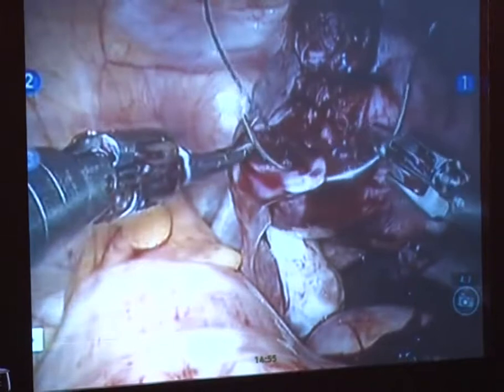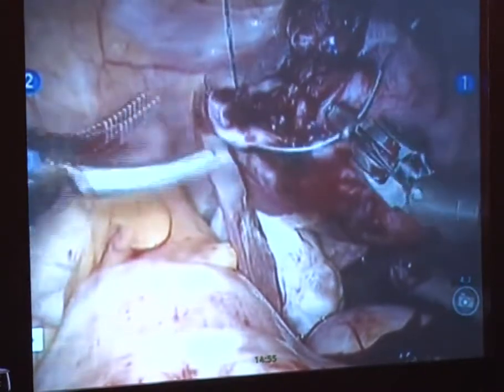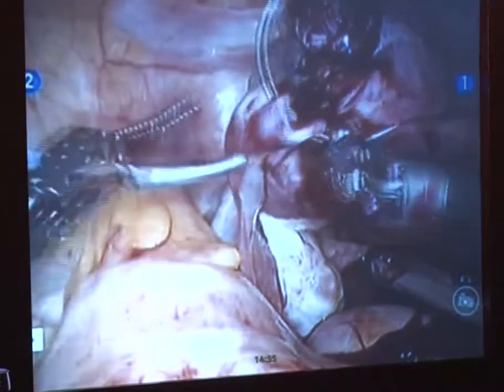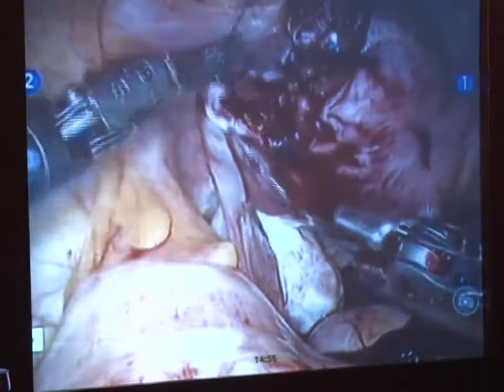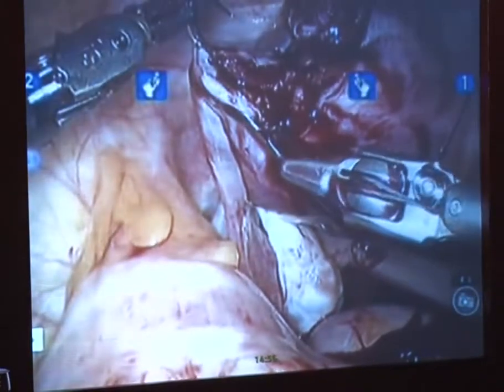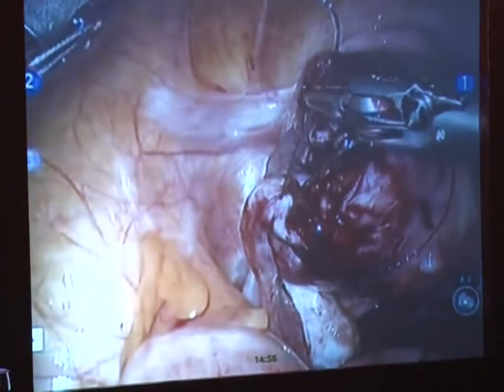Oh, yes, you can. It all depends on the patient's body habitus. These ports are basically supra-umbilical port placement for her. And yes, you can take it up to that level. It just depends on that individual patient, what it looks like. And in that case, where will be our operating ports?